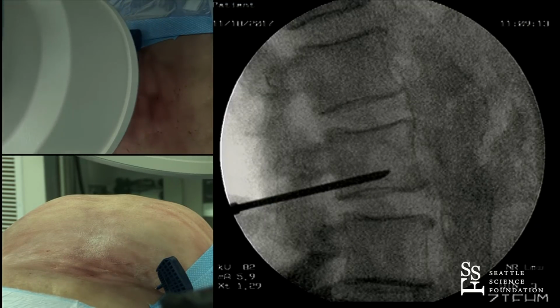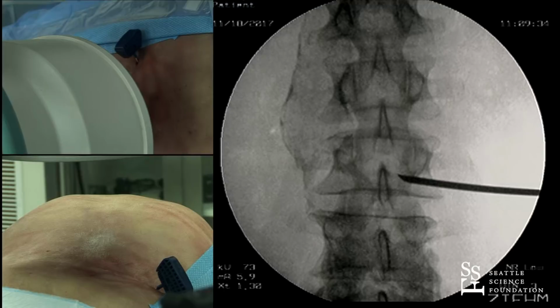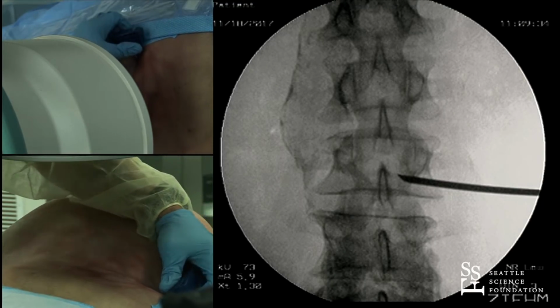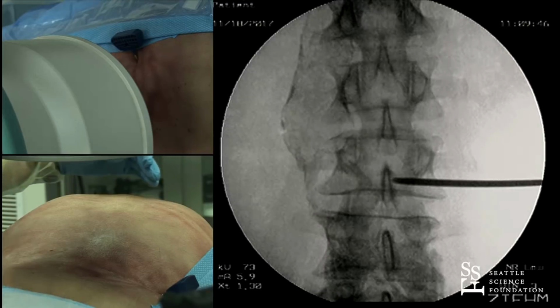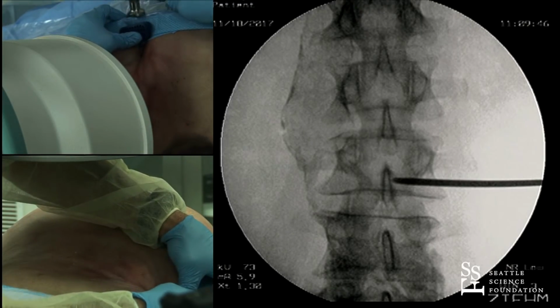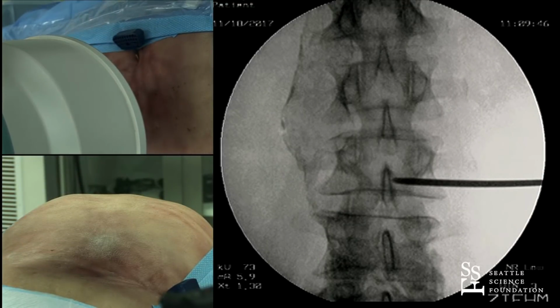And so if this looks different to you, it should. This is a very different approach. It's not at or around the superior portion of the pedicle. It's along the inferior portion of the vertebral body. And so if we want to get a little bit more toward the center, we can angle this as much as we want to. And if you look at the camera that's focused on my hands, you can see how much torque you can put on this just to put it right in the center of the vertebral body.